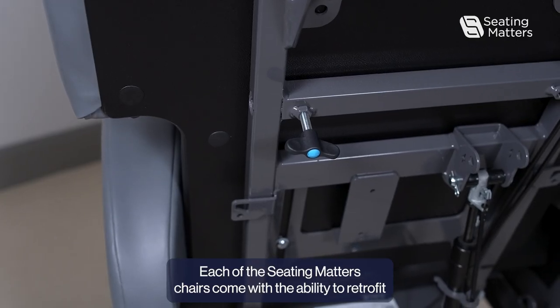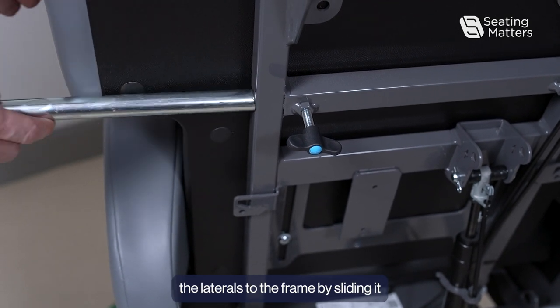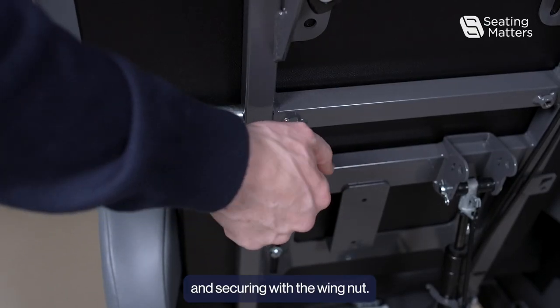Each of the Seating Matters Chairs comes with the ability to retrofit the laterals to the frame by sliding it into position and securing it with the wingnut.